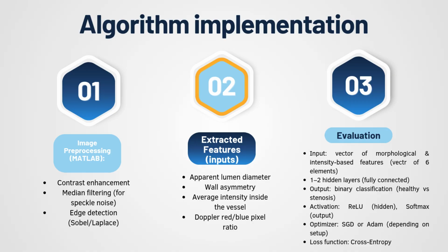First, we load and analyze 77 ultrasound DICOM images. We apply processing steps like grayscale conversion, logarithmic transformation, and median filtering. Then, using a threshold based on intensity, we segment the relevant region, typically the catheter and the vascular walls. Around the bright pixels, we extract a local patch and calculate 6 features, including intensity, variability, red and blue color proportions, segmented area, and continuity.